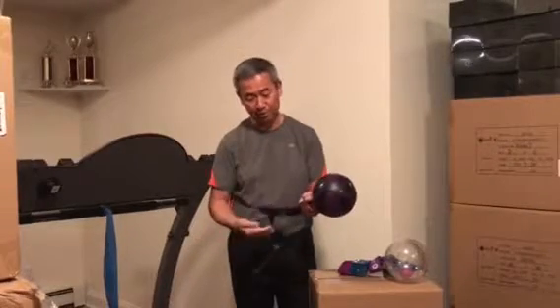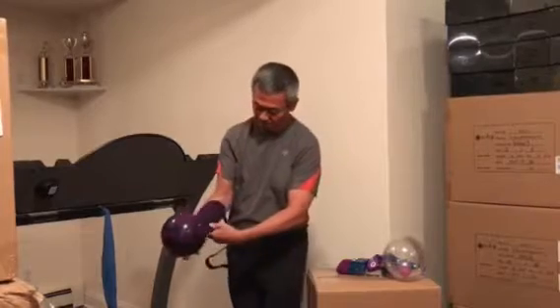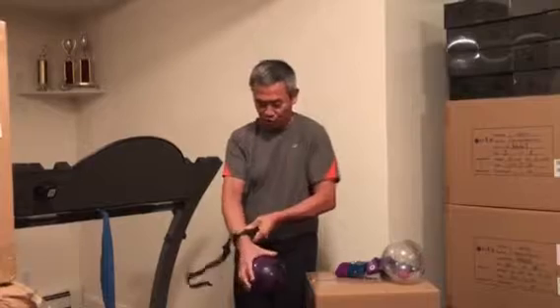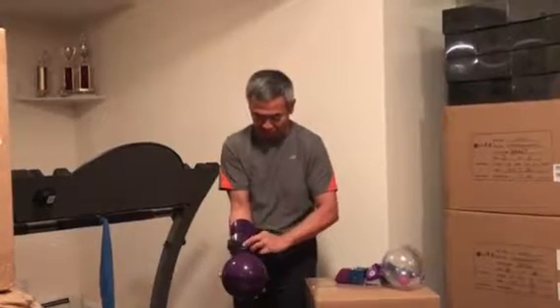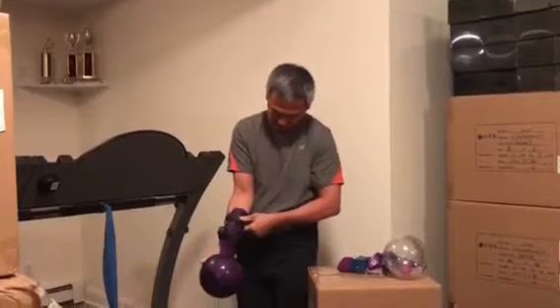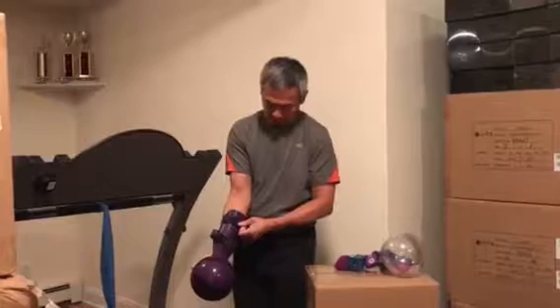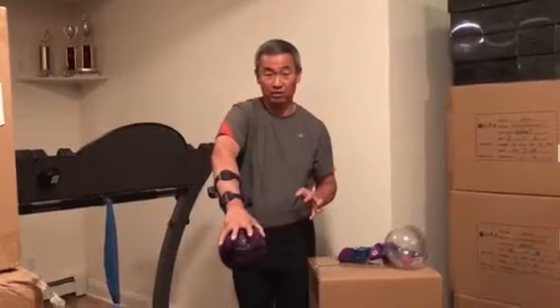So again, you put it on by keeping the hand up, nice and relaxed. You pull on the rubber strap, make it secure, so this way the hand is nice and secured on there. And then you slide this in to lock it in position. You pull this up, now lock it in, and you secure it in like this. So now you do the same exercise again with a thumb and the little finger for support.